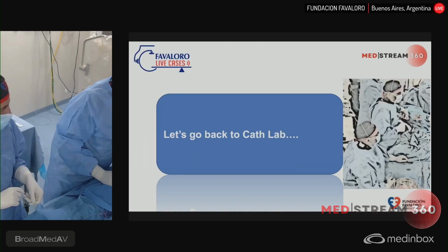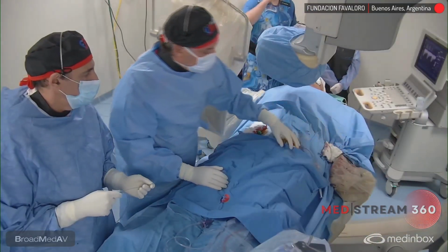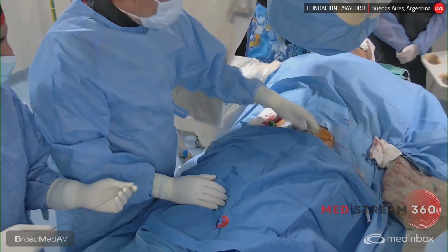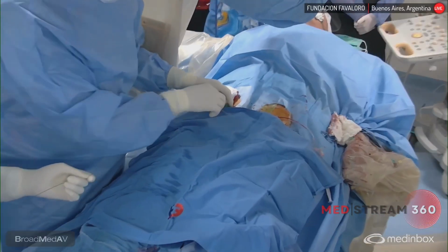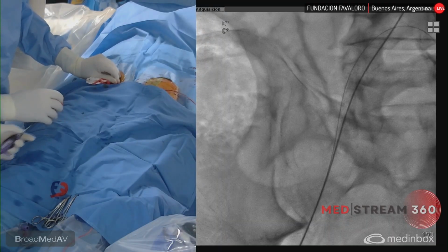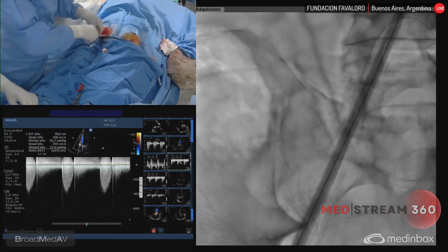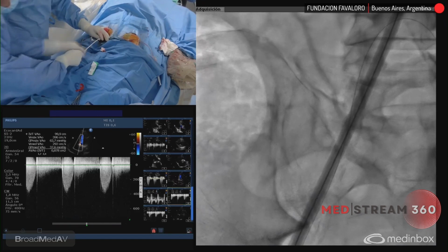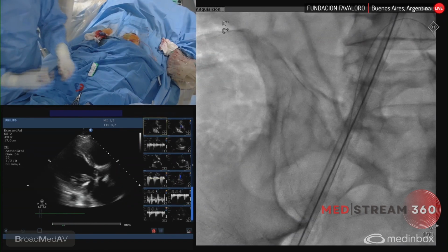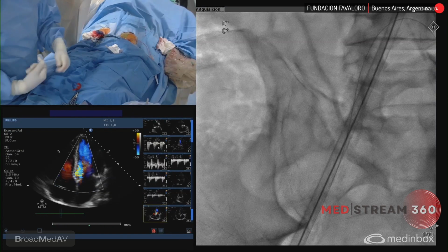Dr. Fava has prepared a radial access here, a 6 French left arm. We have contralateral access for protection and to introduce the pigtail. We have a 6 French that we have already done. So we are going to introduce one ProGlide and one Angio-Seal in this case. So now we have introduced the sheath for homolateral access. We are going to introduce the right coronary artery guiding.